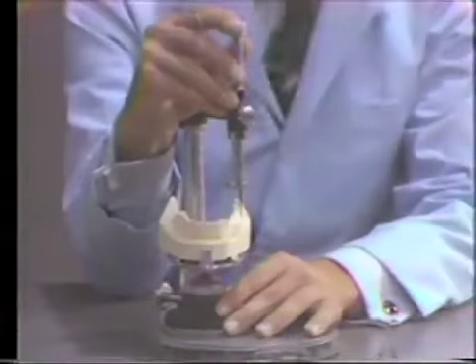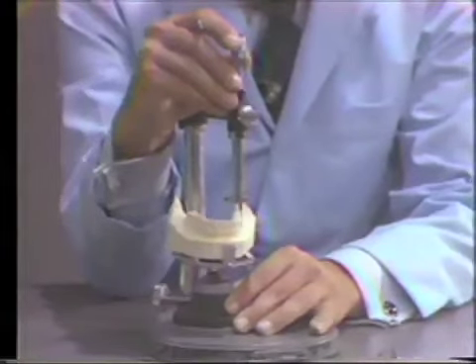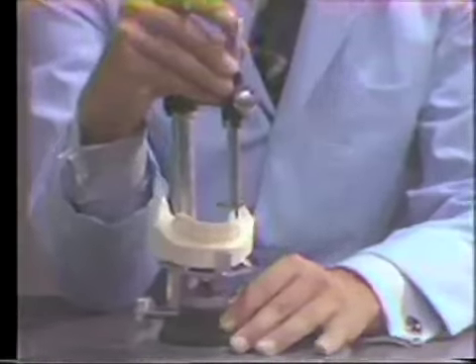And we're going to cross over and check the buccal for residual ridge undercuts. Now this is probably as far forward as that saddle area is going to go, and in this area we can see a slight undercut. In this area right here, I'm sticking the instrument between the cast and the analyzing rod to show that there is an undercut. The height of contour is high here, where the root for the terminal abutment has made this soft tissue very prominent, and then below that I have an undercut.